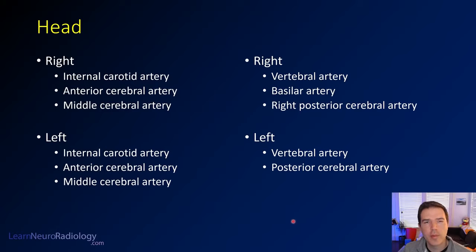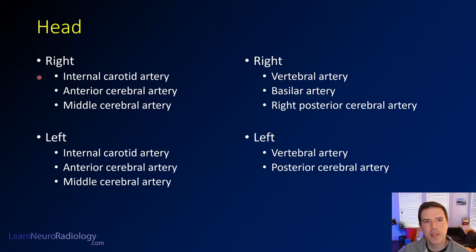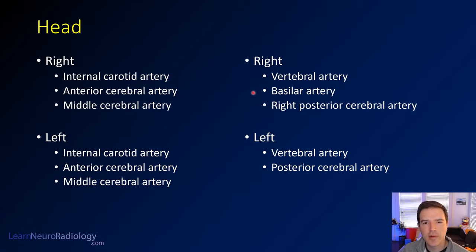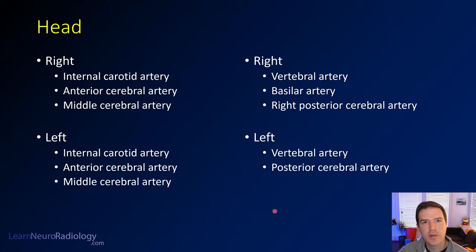Now we move on to the head, following a similar pattern — anterior to posterior, then right to left. We'll start with the anterior structures, including the internal carotid artery, anterior cerebral artery, and middle cerebral arteries — right first, then left — before going posteriorly to look at the vertebral artery, the basilar artery, the right posterior cerebral artery, then the left vertebral artery and left posterior cerebral artery, passing by the basilar artery again as we go.